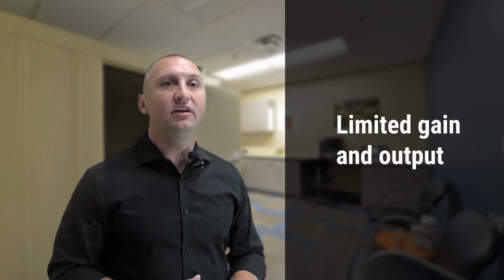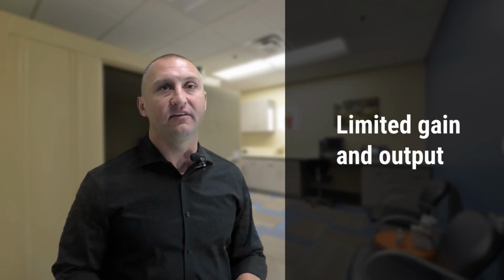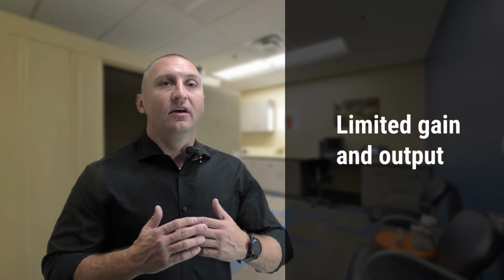On the other hand, when compared to a prescriptive fitting, the hearing aid was well underfit, especially in the mid and high frequencies. Unfortunately, as a person starts with hearing aids, they like the sound softer until they acclimate. But once they acclimate, they want that extra volume. It really does help their brain understand and grasp onto speech, especially in the presence of background noise. So unfortunately, what I see happening with products that work this way is initially, patients are going to be very happy. That's probably going to last 2, 3, 4 months. Then what's going to happen is they're going to want more volume, and it's not going to be there.